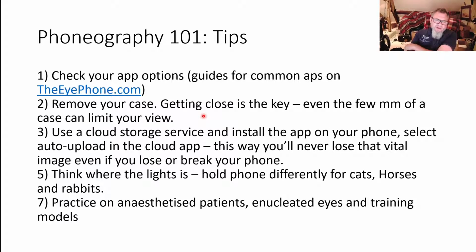Third tip is to use a cloud storage service, such as Google Photos or Apple Photos. There's several others on the market as well. If you can get your camera apps to automatically upload to the cloud, then even if you lose your phone or break your phone, you'll know you've got that critical photograph, be it of your patient or of your family.